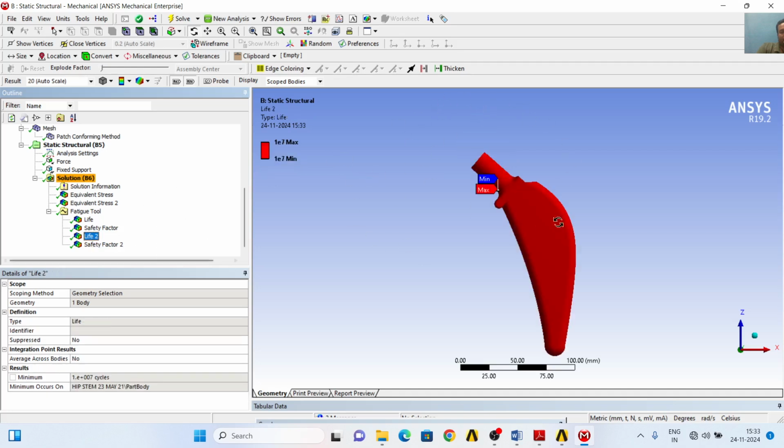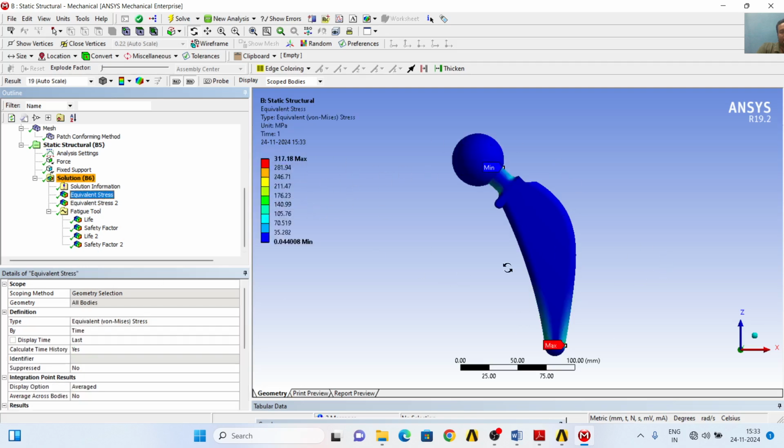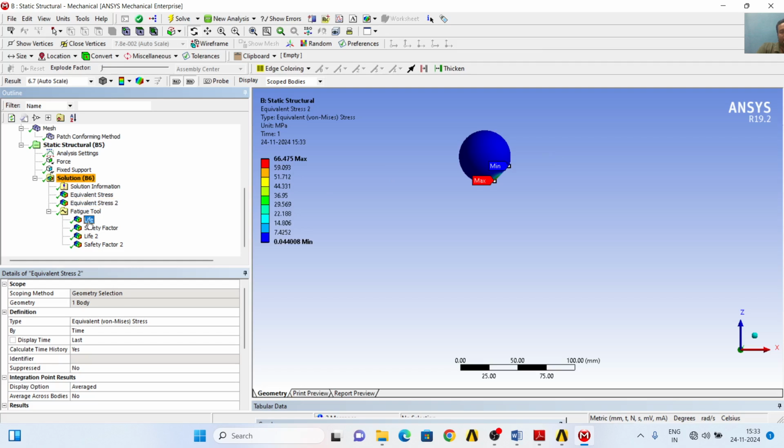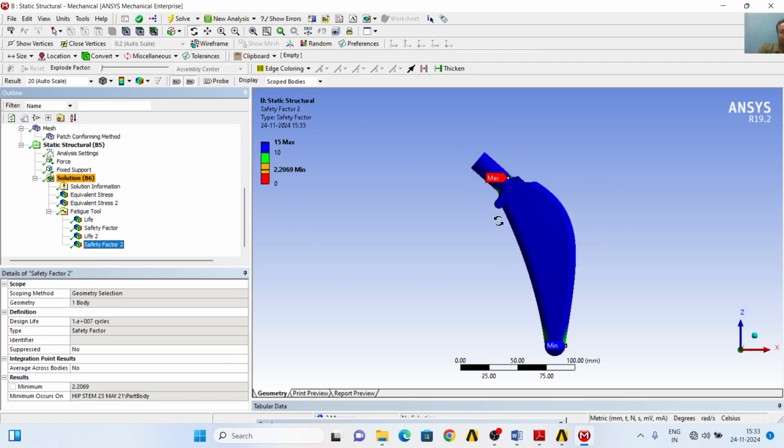Okay, and for the stem there is also the life of 1e7, which is 10 to the power 7 life cycles. The stem is also going to survive, and the safety factor for the stem will be 2.2069, which will be considered as safe as per the engineering design aspect. Okay, so we have now seen how we have calculated the stresses for the stem, all bodies, and particularly the head, and the life for head, safety factor for head, life for stem, and safety factor for stem. So in this way we have calculated and shown that the alumina head material and titanium stem material are going to survive 10 to the power 7 fatigue life cycles.